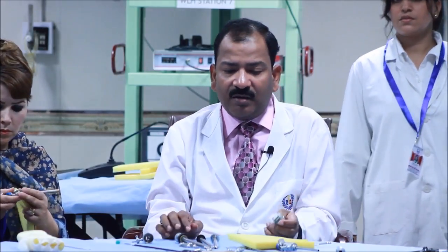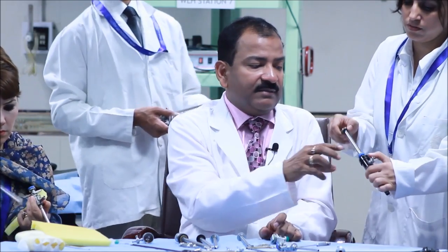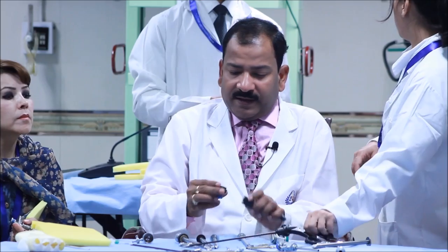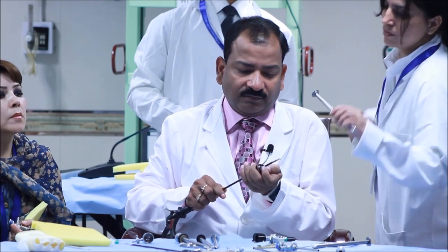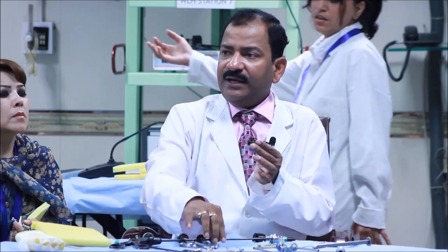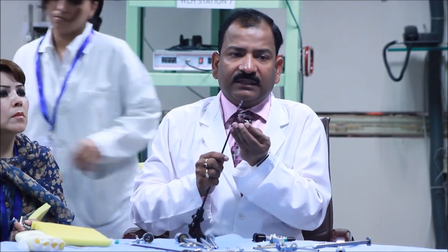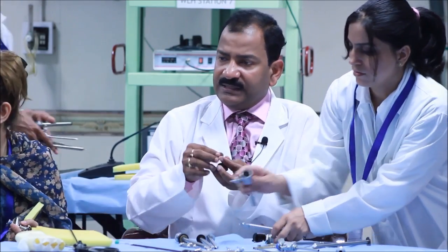There are a few valves which have a magnetic valve. Magnetic valves, this is called a flap valve. This is a magnetic valve. Inside there is a magnet. Here, if you will see that, this is a magnetic valve. Here it is, and it is attracting the magnet there. Can you see? So, once it goes, it will open. And it is closing. This is a magnetic valve.